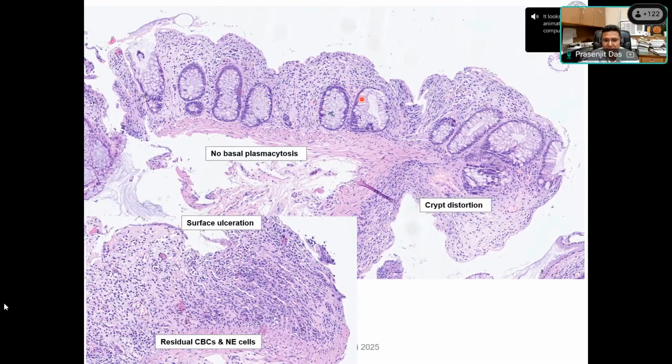Draw a line. See if similar inflammation is there in both the zones. Your voice is breaking. The others, you can also speak up, no? What is the issue? So, density of inflammation, though it is very mild, you can see similar density is present in both the areas. That indicates there is redistribution. Otherwise, you would have seen more inflammatory cells in the upper half and very few in the lower half. So it is mildly inflamed.